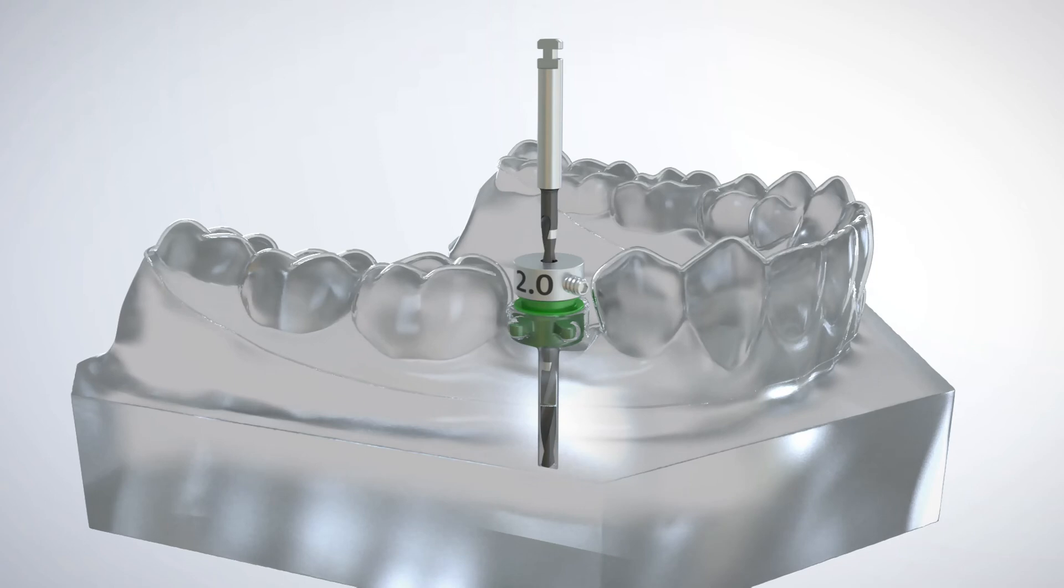The initial pilot drill with a GRS drill sleeve loosely attached is inserted through the drill sleeve to the full depth of the hole in the printed model. The GRS drill stop is secured to the drill with the drill stop driver.